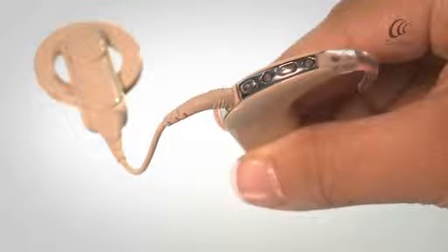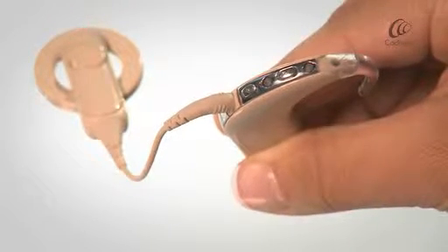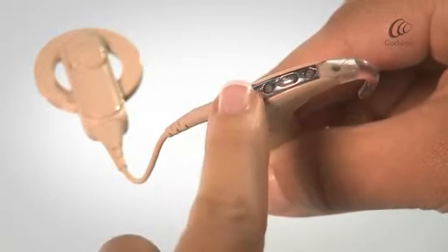To switch on the sound processor, press and hold the lower button until the LED light turns green.